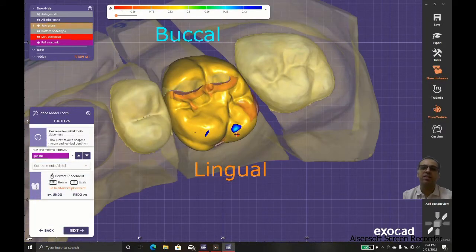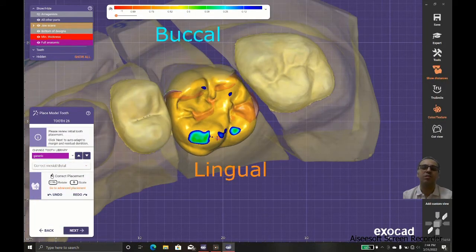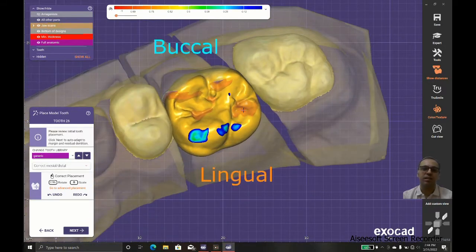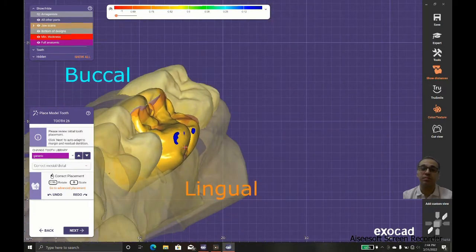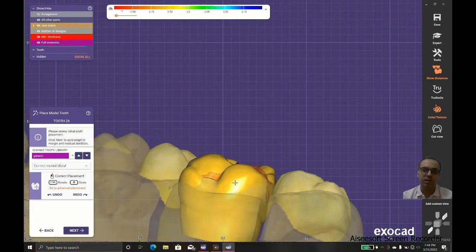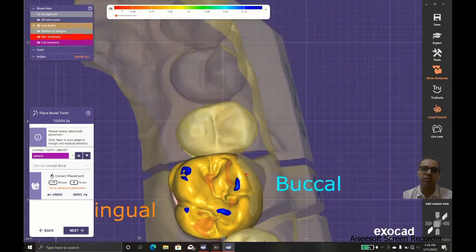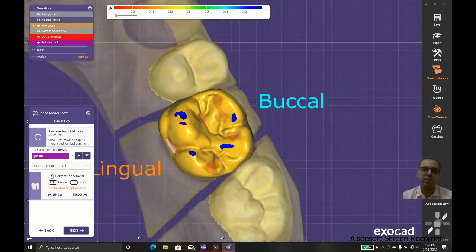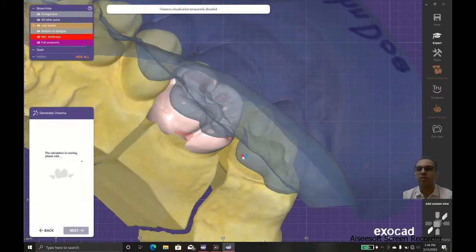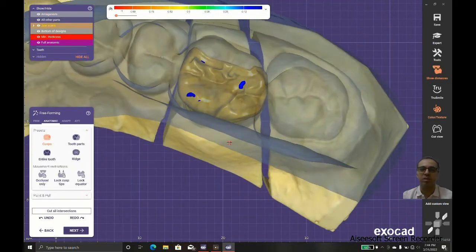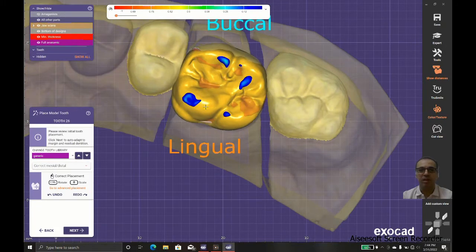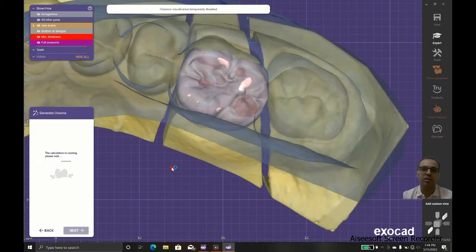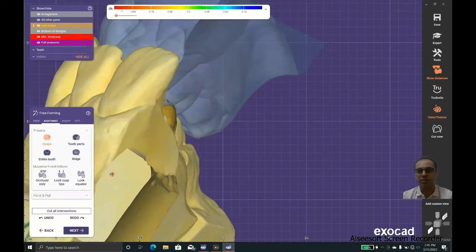In some cases we need to change the libraries and find the teeth that match that dentition, like worn dentition or used dentition. Maybe they need a different kind of library.